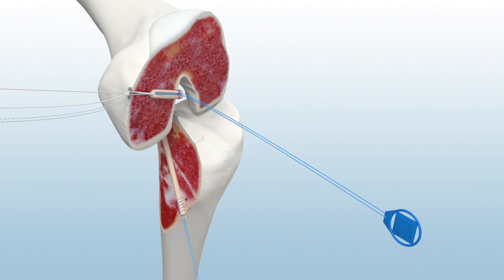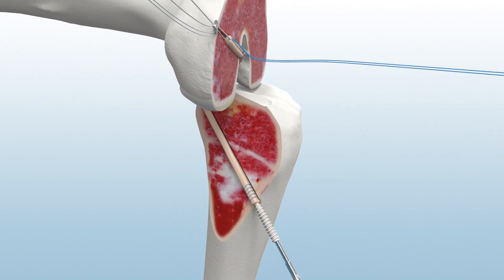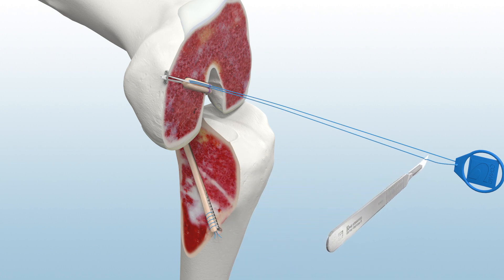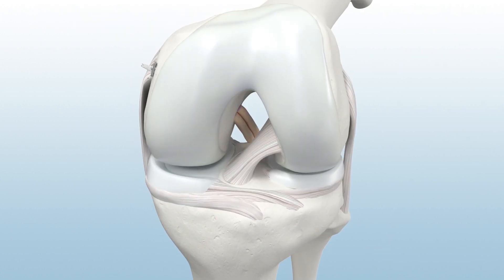For tibial fixation, cycle the knee and fixate with a Genesis Matrix Interference Screw with the knee at 90 degrees of flexion. Finally, remove the lead suture and cut the femoral button's suture limbs at the skin, taking care not to cut the friction lock. Then, trim any excess tibial graft limbs. Cut one of the reversible button tab sutures to remove, to complete the reconstruction.